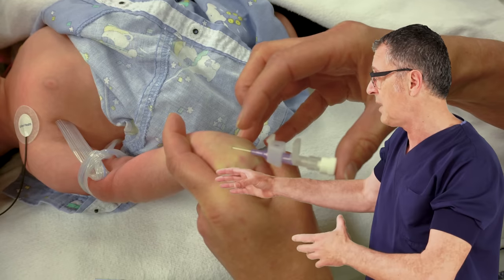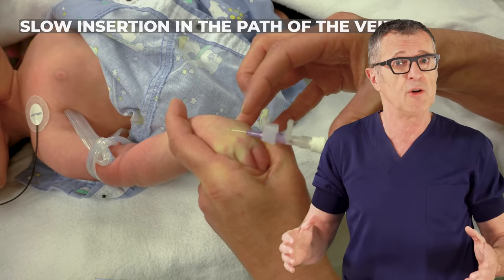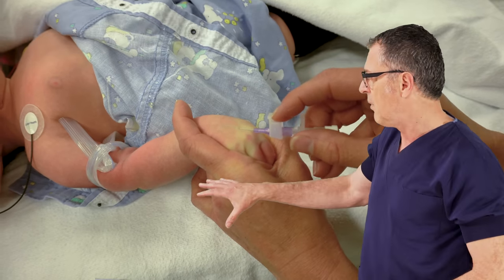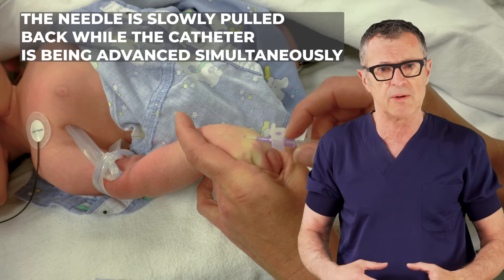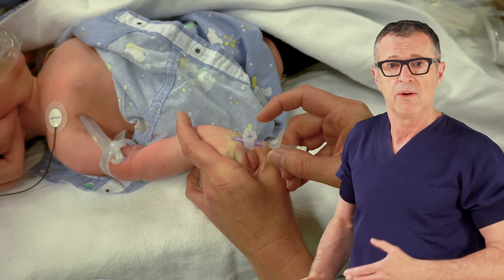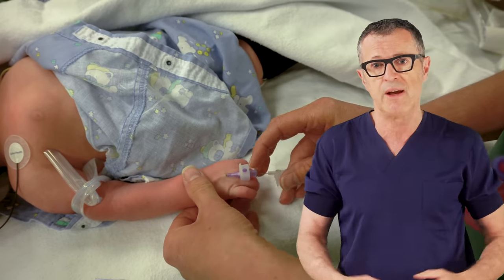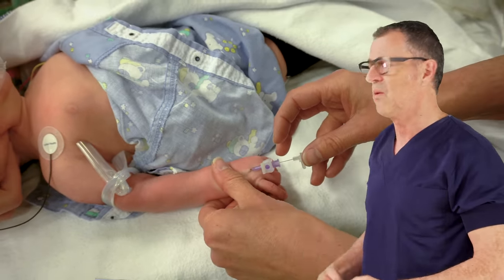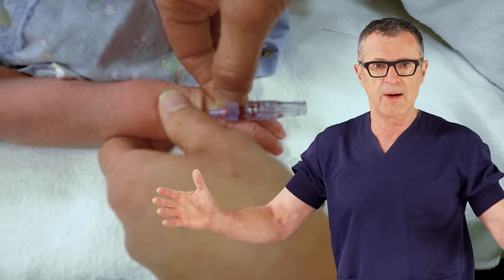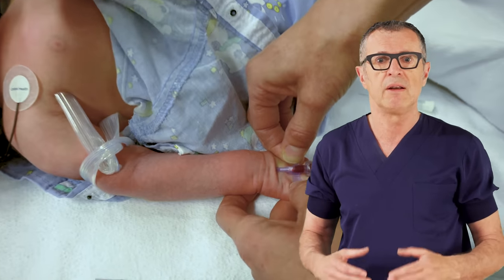This is really the key to this procedure: you have to be able to fix and stabilize the vein so you can enter it with a catheter, and yet not obstruct or collapse the vein. At a very low angle of needle insertion, go very slowly until you feel a certain give or pop — that is the point when the cannula with the needle enters the vein — then slowly withdraw the needle, leaving the catheter or cannula inside. And voila, that was a very skillful placement of an IV line in a small baby.